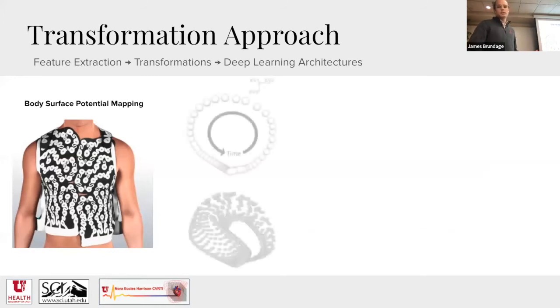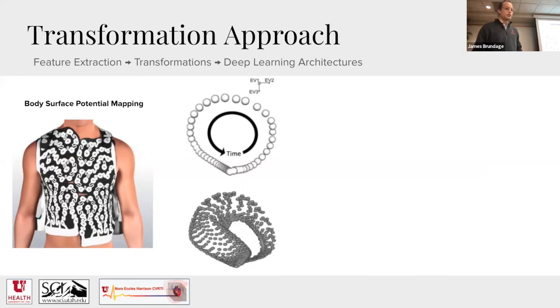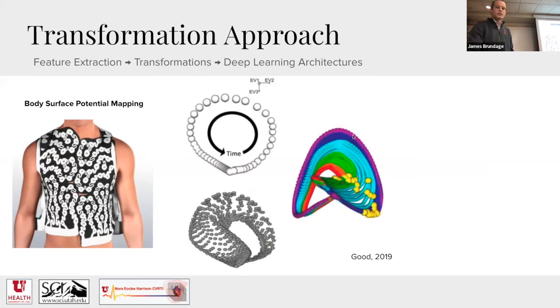And so what he did was start by embedding those really high dimensional recordings into a lower dimensional space using an approach called Laplacian eigenmapping. And so in doing so, he created this three-dimensional space where, when a heart underwent ischemia, we can see the purple out here is this space when the heart is healthy. And we can see that as the heart undergoes ischemia, so as it becomes more like a heart attack, right? There's less blood flow. The shape kind of crumples in this lower dimensional space. And this yellow dot here represents a metric that was used to quantify that, which ended up having really good predictive power at showing when something was in ischemia or not.